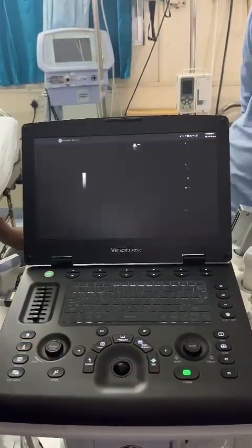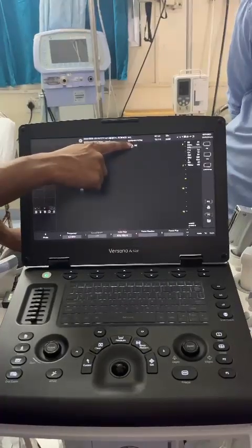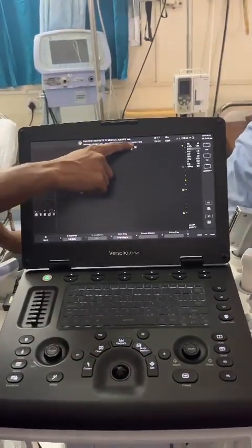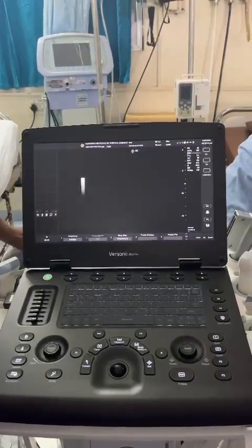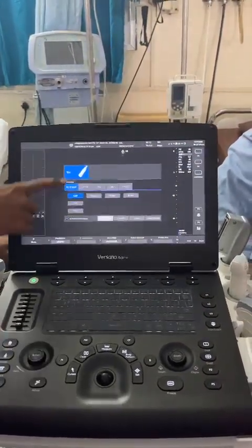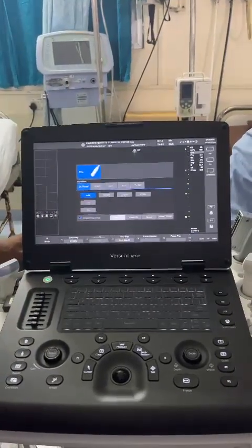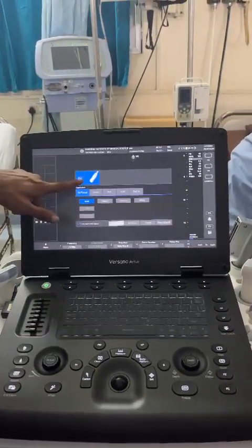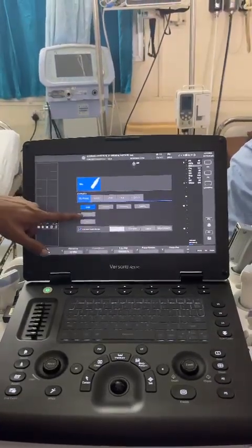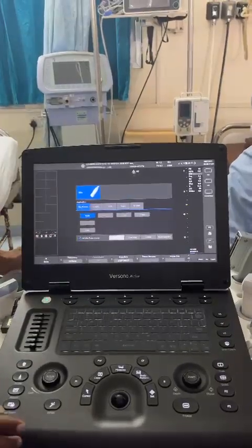Go to scan. Here you'll observe the test patient name and the patient ID. Coming to the probe: you can only select one single slot. For each probe, it has its own application and examination settings. Each preset has its own parameters.